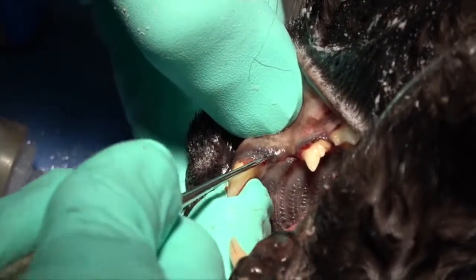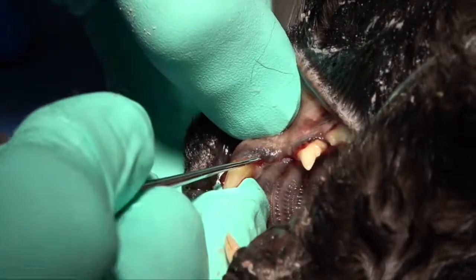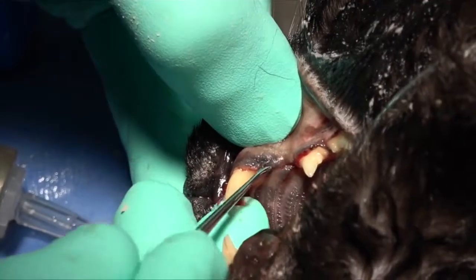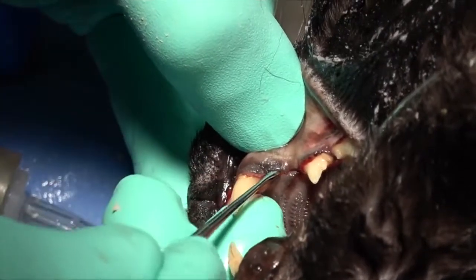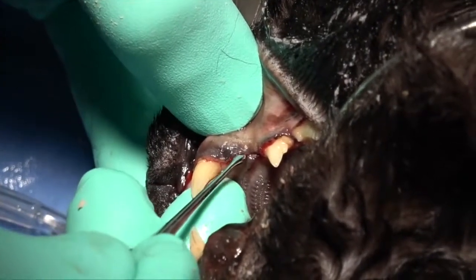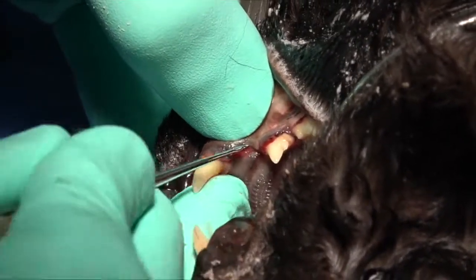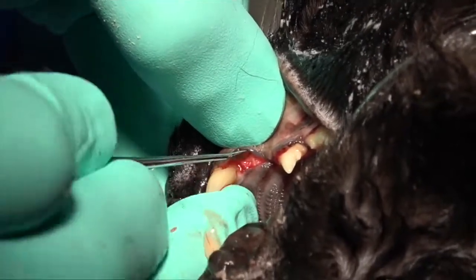We're using a small end of a periosteal elevator — that's an EX9 periosteal elevator, specifically for feline — and we're just working that underneath in that rocking motion, trying to release that attached gingiva, being very careful not to tear that gingiva at that level.